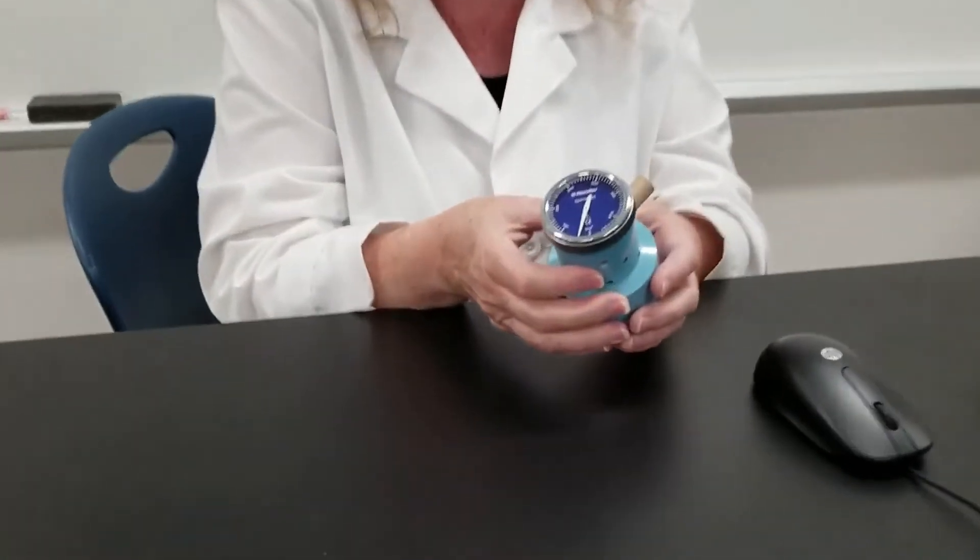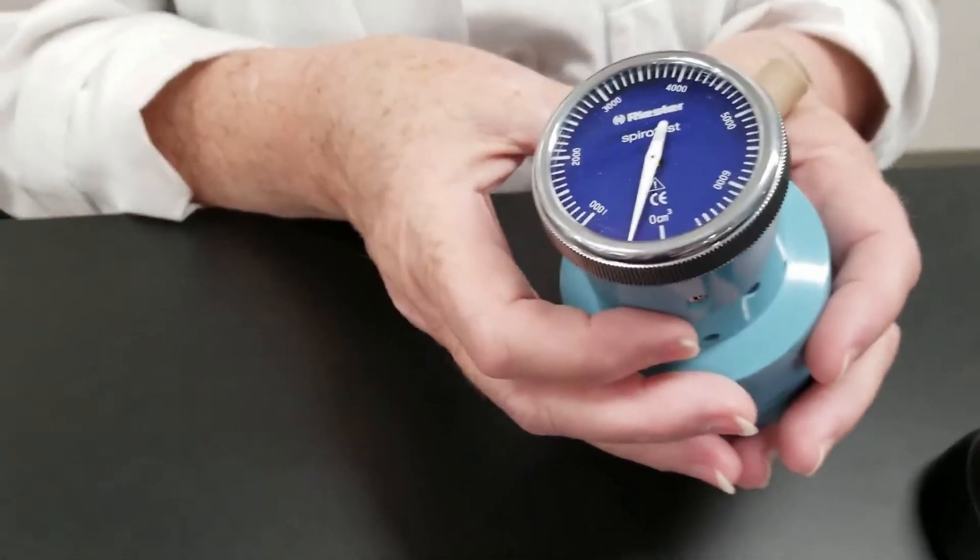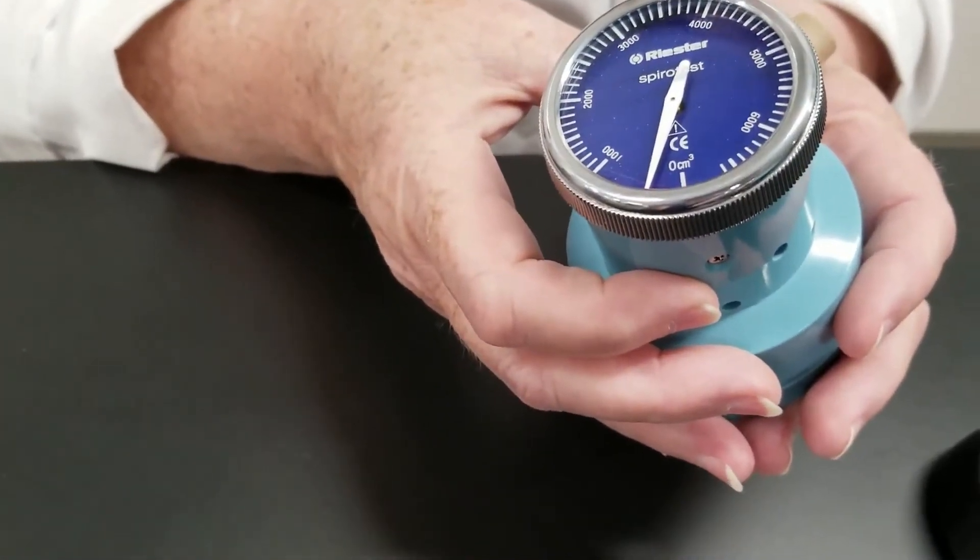For tidal volume — that is the amount of air that's exhaled or inhaled just during normal breathing — I've just been breathing normally, and what I'm going to do is just blow into this. I did not do any exaggerated hard exhaling, and we'll just measure the number, which was not real high, about 500.